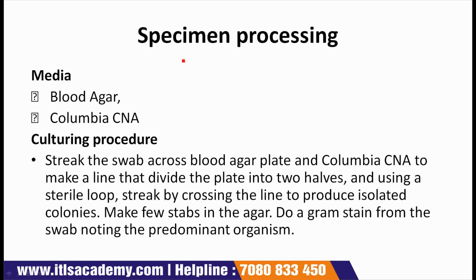Next comes specimen processing. First we will see the media used for the processing, and the media are blood agar and Columbia CNA. Culturing procedure.